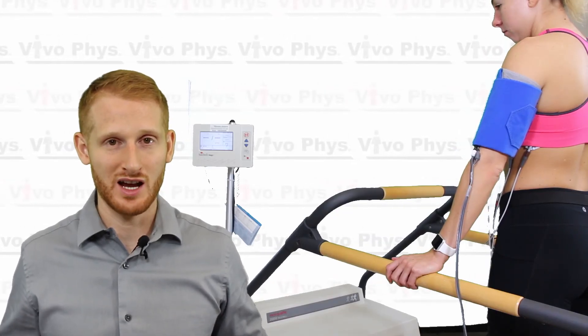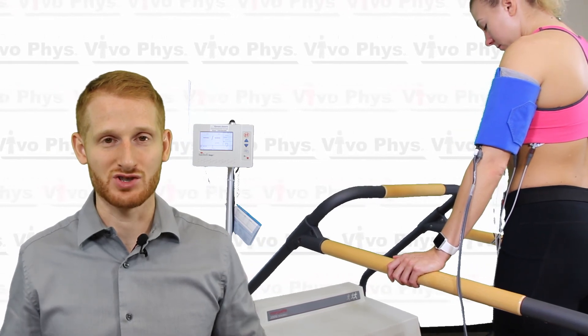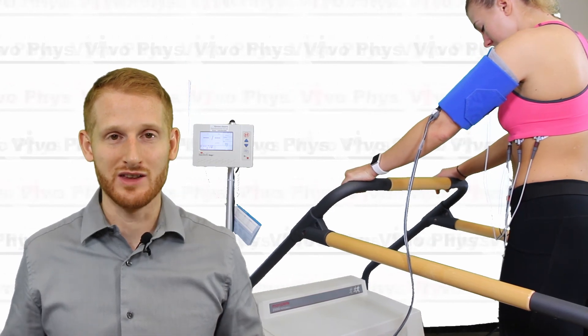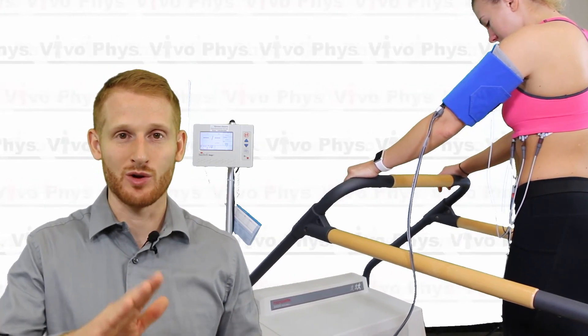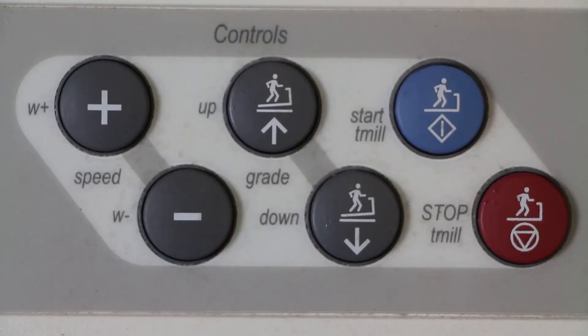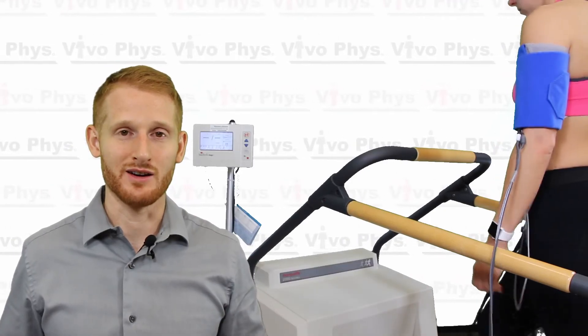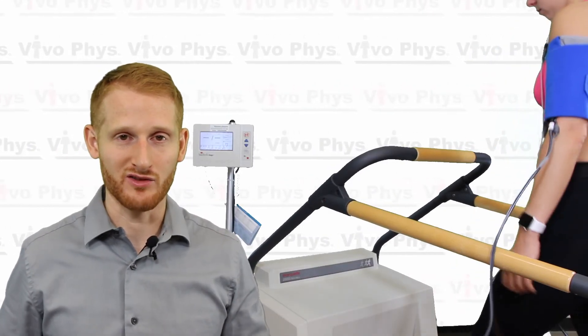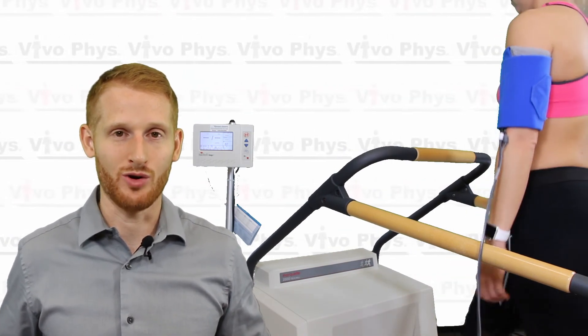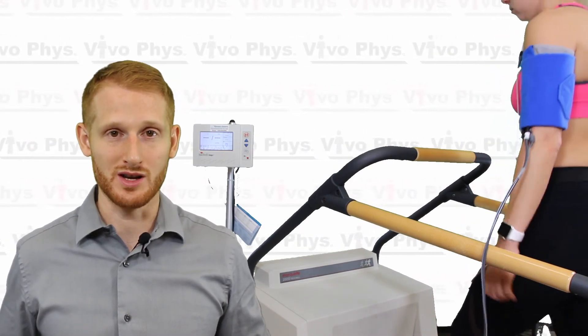Before you hit the exercise button, you should have had them holding the handrails and straddling their feet on the two sides of the belt so they're not actually on the belt. When you hit the exercise button, things go up and then have them just stay in that position and then hit the start treadmill button. Have the person slowly ease on to stepping on the belt, making sure they're doing so in a way where they're safe and they're not going to stumble. Once they are up to speed and they're comfortable walking on the belt, have them let go of all the handrails and try to have them not hold the handrails for the majority of the test.